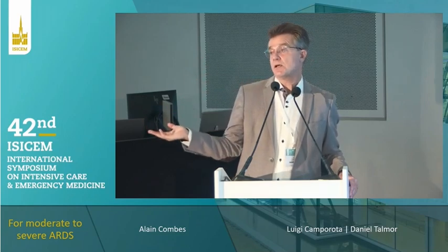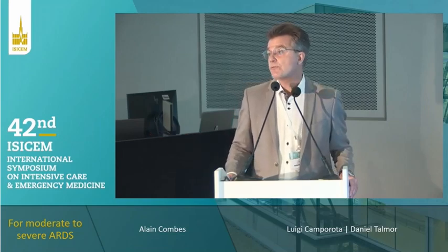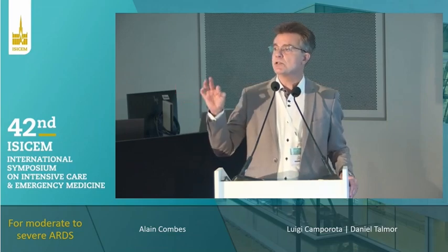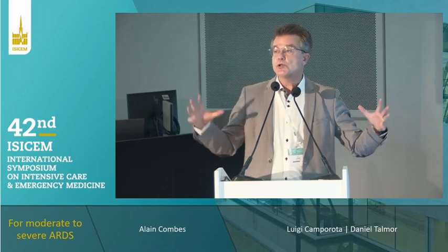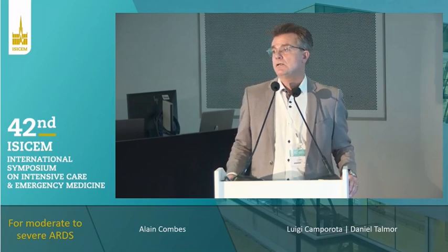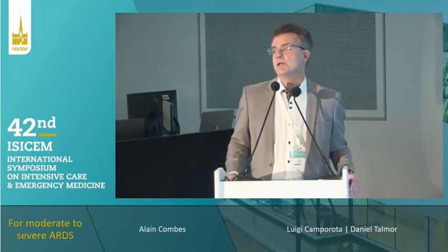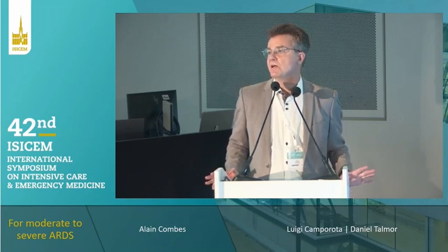So you still stick with the classical heparin and fraction heparin strategy, and you need full anticoagulation in these patients. Otherwise, the device will clot. Those membranes are large membranes. It's close to an ECMO membrane, 1.5, sometimes a bit bigger in square meters. So if you do not anticoagulate the patient, the membrane clots within minutes. This is the major limitation for now of low-flow devices.